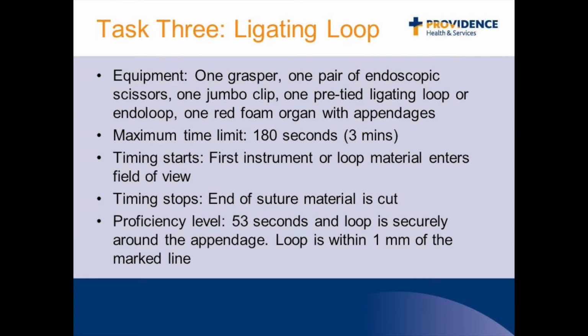You will have a maximum time limit of 180 seconds to complete this task. Timing starts when the first instrument or loop material enters the field of view and will stop when the end of suture material is cut.